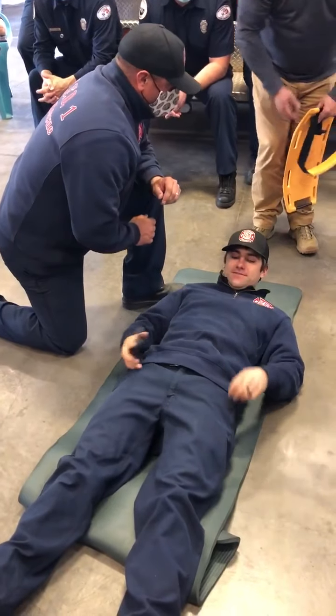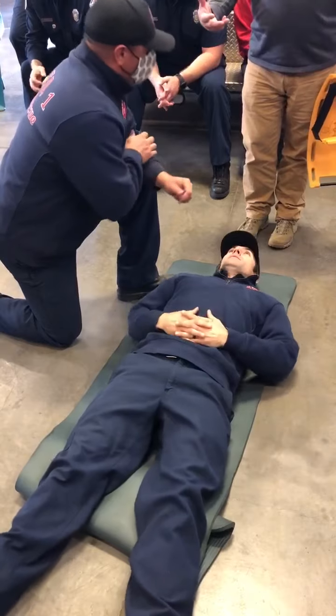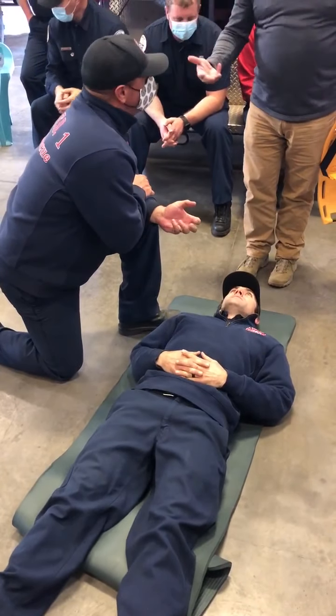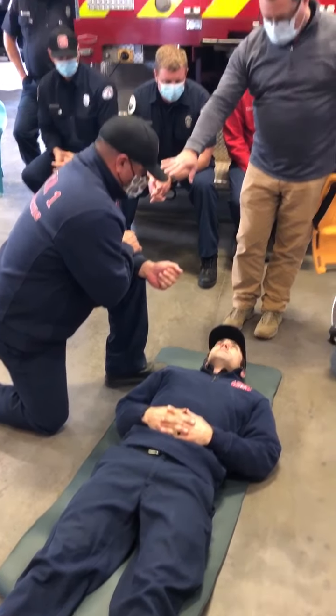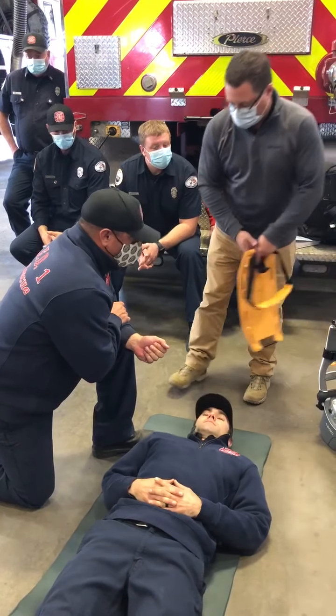Could I put this between my legs? Could I have a partner handing me this as I go? Now, this is a two-person deployment. You might be looking at a three-person deployment. If he had to do this himself, he could. Okay, so you've got to think in those terms. What are my resources looking like?